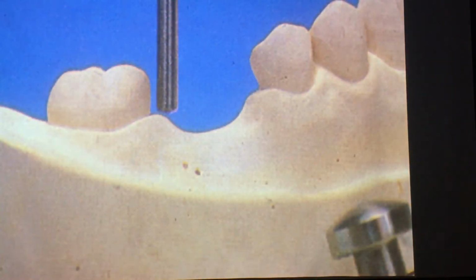You can see here with the survey spindle, or excuse me, the analyzing rod, how parallel it is to the guide plane or proximal surface here of, looks like a 3.7 or 2.7. Regardless, this molar on the mesial surface, the guide surface, is parallel to the survey spindle. But if we move that analyzing rod, survey spindle, the analyzing rod, over to the distal proximal surface of the second bicuspid, you will see that there will be an undercut created here.